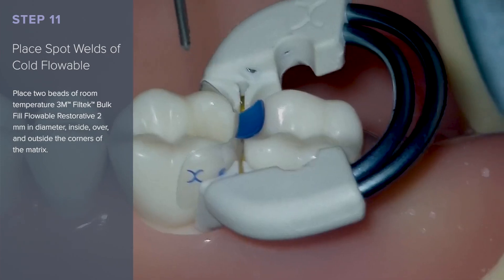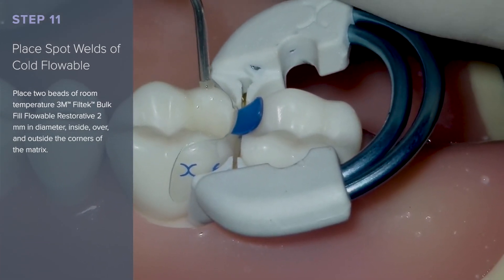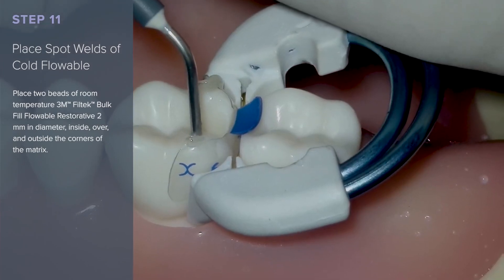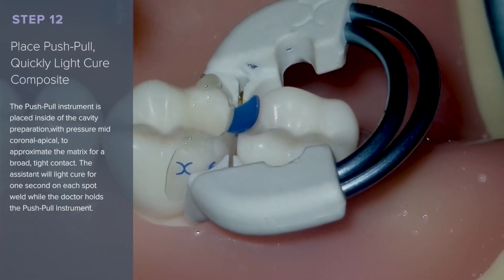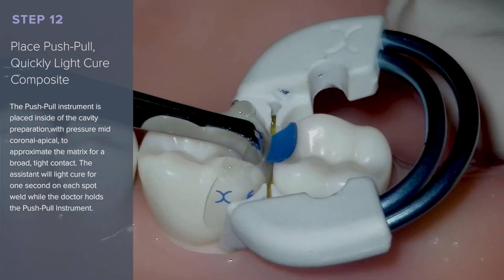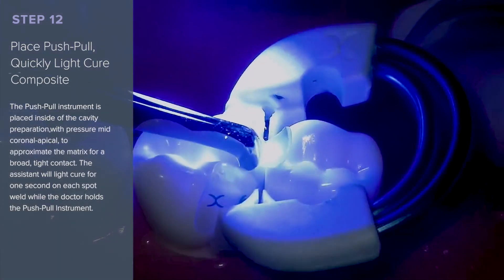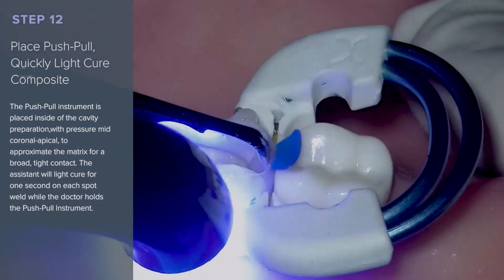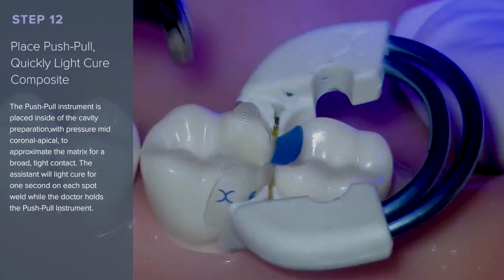Place two beads of room-temperature 3M Filtek Bulk Fill Flowable Restorative, 2 mm in diameter, inside, over, and outside the corners of the matrix near the cusp tips. The push-pull instrument is placed inside of the cavity preparation with pressure mid-coronal apical to approximate the matrix for a broad, tight contact. The assistant will light cure for one second on each spot weld area while the doctor holds the push-pull instrument.